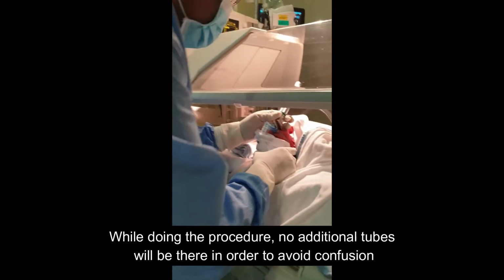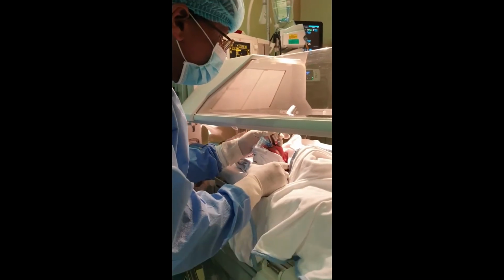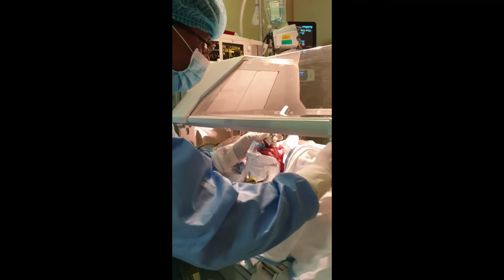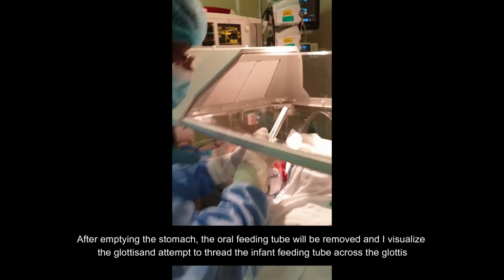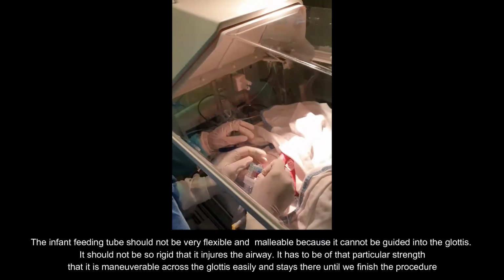While doing the procedure, no additional tubes shall be there in order to avoid confusion. So, the preparation of the baby before giving surfactant in this instance will be emptying the stomach, the oral feeding tube will be removed, and I visualize the glottis and attempt to thread the infant feeding tube across the glottis.